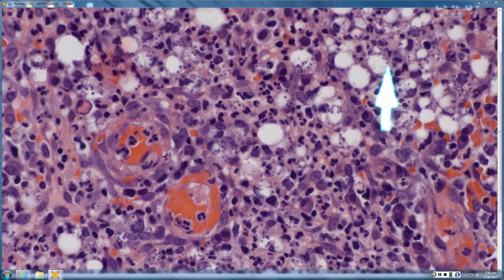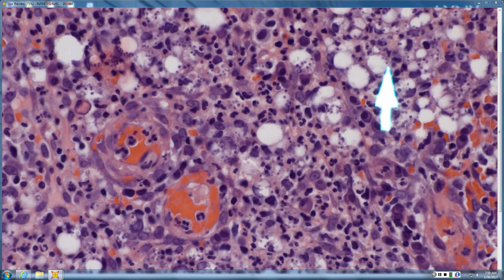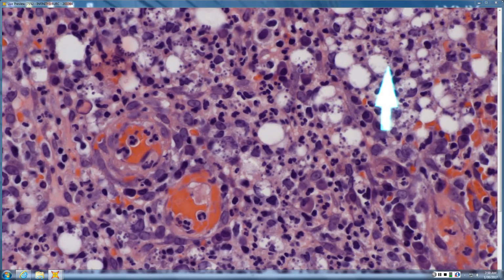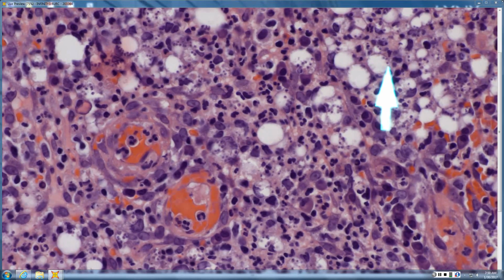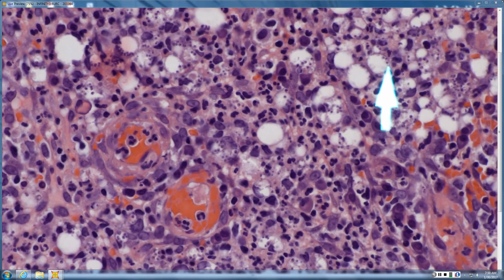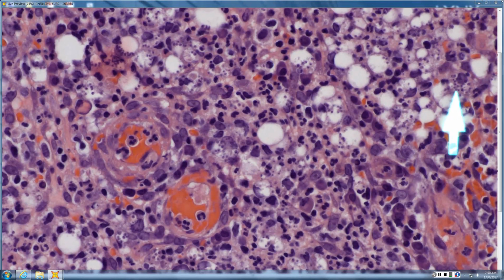So it's been called the makeup mirror sign or the movie marquee sign, with the little light bulbs, the little circles at the outside of the vacuole. That's kind of typical for leishmaniasis. They will sometimes cluster within the vacuole into little groups, little clusters all at one side, whereas histo tends to be very evenly spaced throughout the vacuole.